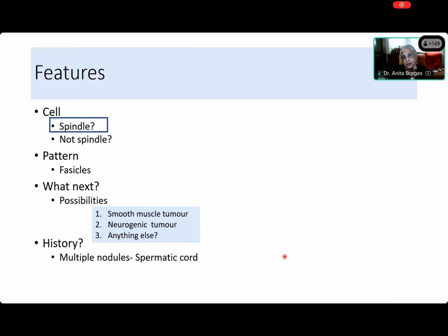Have you heard of a term called leiomyomatosis? Yes, ma'am. Where do you get that? They occur in females, right? Sometimes multiple leiomyomas, and then they might seed the peritoneum, and you get leiomyomatosis. Is it possible that this is leiomyomatosis only that it is occurring in a male? There is a possibility, right? If you had to make an educated guess on H&E, what would you say? Leiomyomatosis of the spermatic cord. Yes, that is one of the things that you will think about.